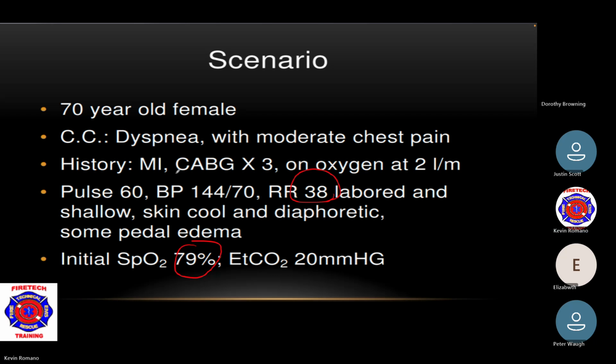Okay. What do you think's wrong with him? For her, I should say. I mean, you want to start CPAP or BiPAP? You want to start giving oxygen. What's your differential? What are you starting to think? We obviously you have a plan in place. You're treating something.